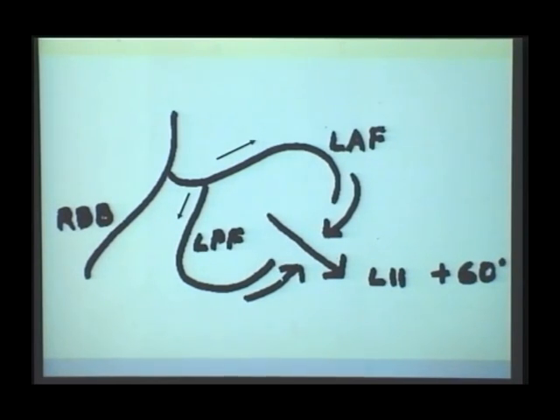You understand this point? So they come like this. So the entire ventricle is depolarized from the sweeping left anterior fascicle and left posterior fascicle. So naturally they meet the center point of lead 2. Most often your normal axis is around L2. This is what normally happens.